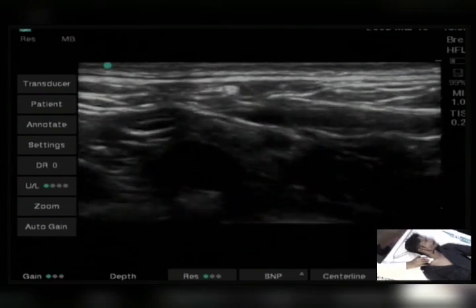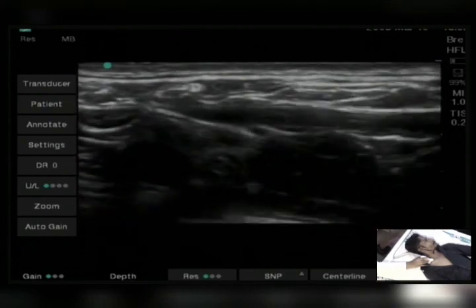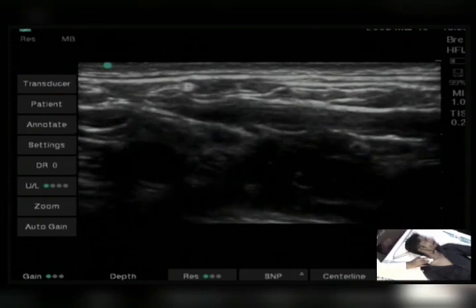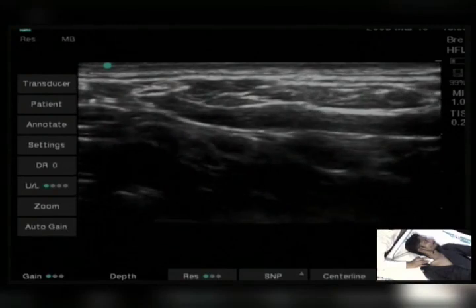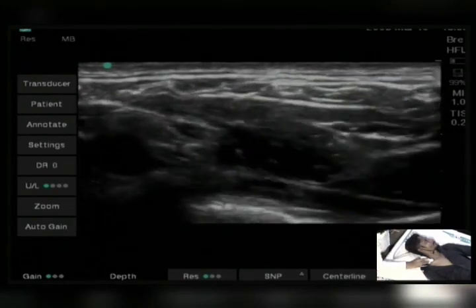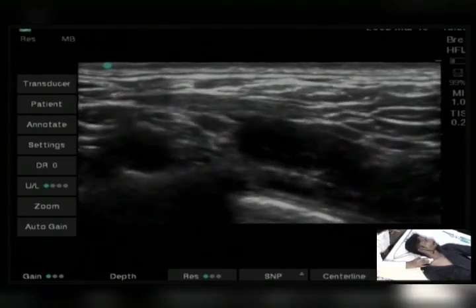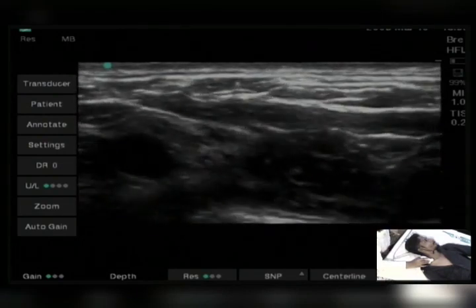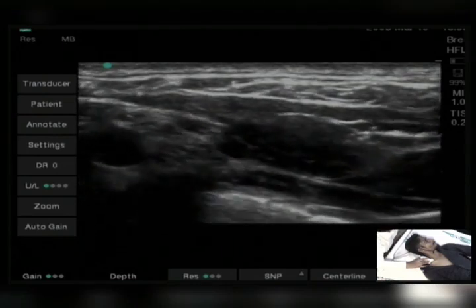See, I am trying for supraclavicular block. We need to see the artery round, and posterolateral to the artery, we will find the plexus. See here, middle scalene is visualized. Okay. So this is the first rib, which shows acoustic shadow, and this is pleura, in which we find a sliding shadow.